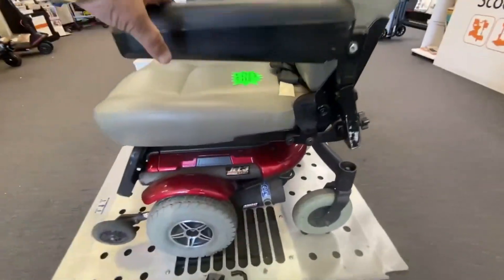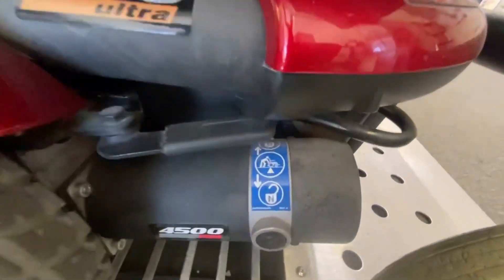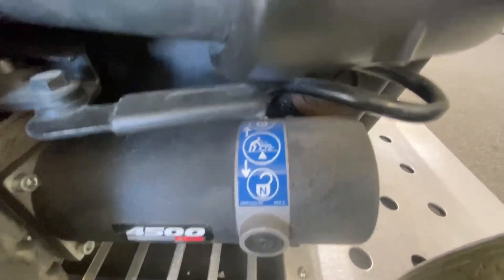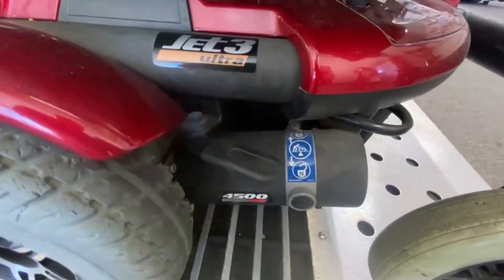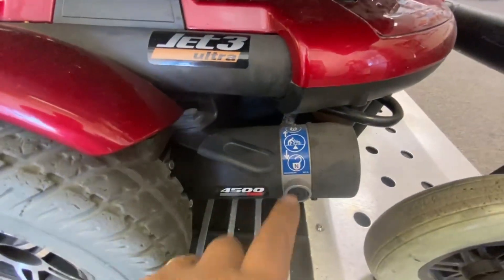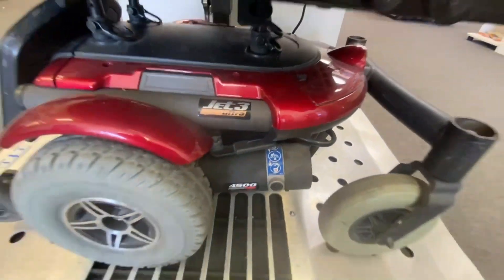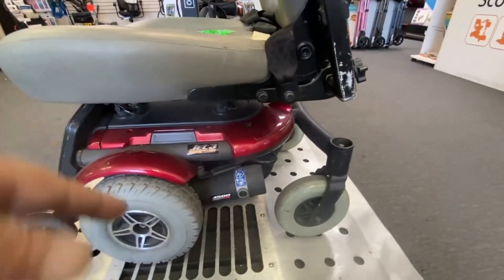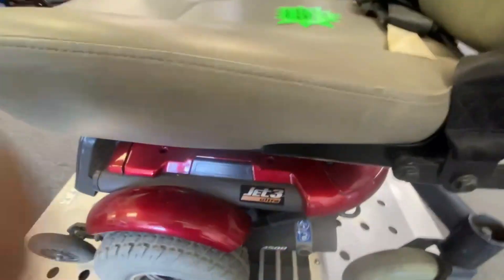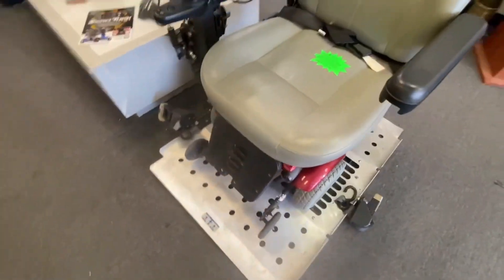On some older models like the Jet 3, also made by Jazzy, you can see on the motor there's a little sticker saying neutral and drive. This is your handle here — you will pull it towards you to put it into free-wheel neutral, and then push it away from you to put it into drive. Like I said, they're sometimes located all over the place — on the sides, at the front, at the back. So look for that and look in your user manual to see where to find it.